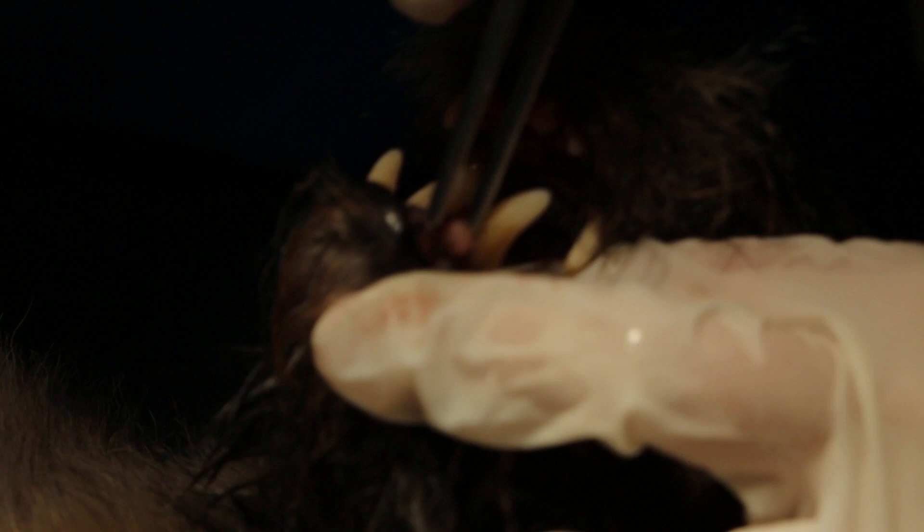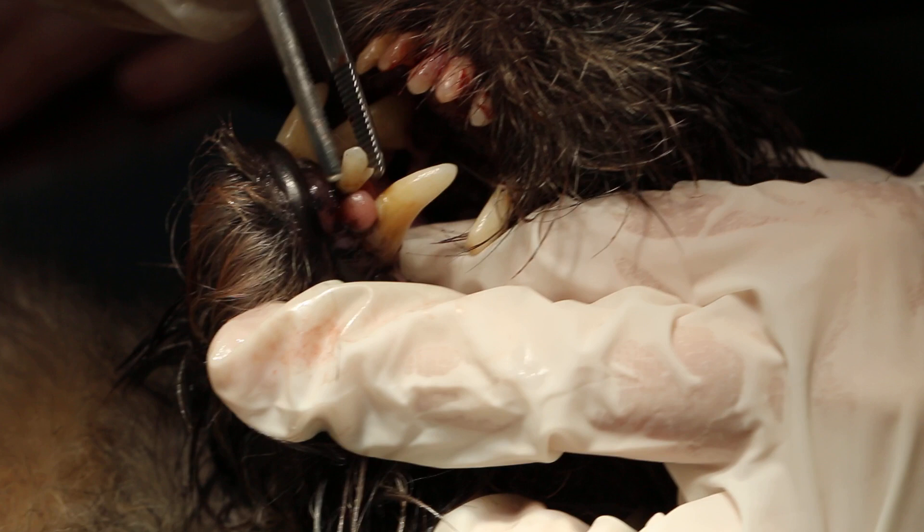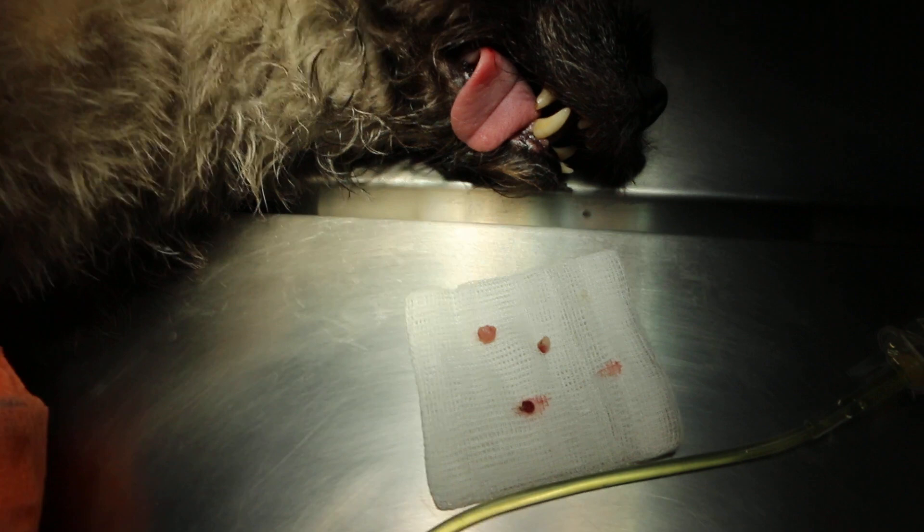You can see that if you do dental early, you will not have this problem. But sometimes it's due to old age. It might be cancerous, it might not be. Anyway, we will remove it now, then do dental scaling, which is the usual standard one. The dog is under sedation — Domitor plus ketamine at 50% of the dose. We will stop now — so there are actually four gum tumours.